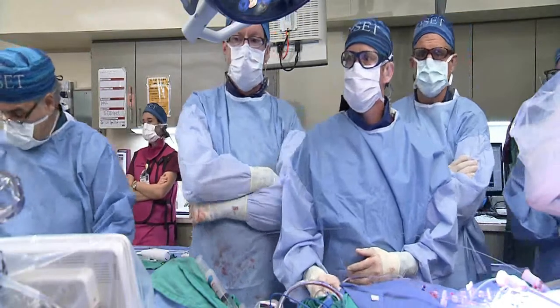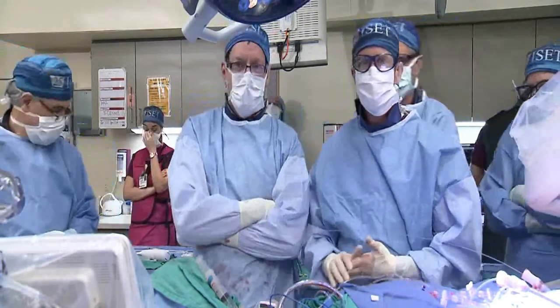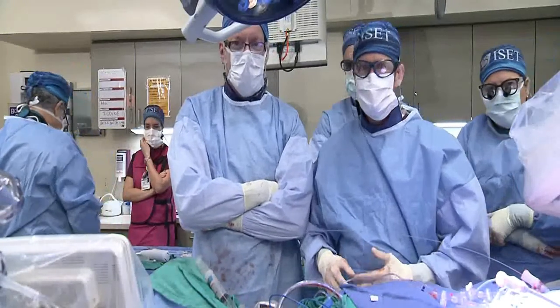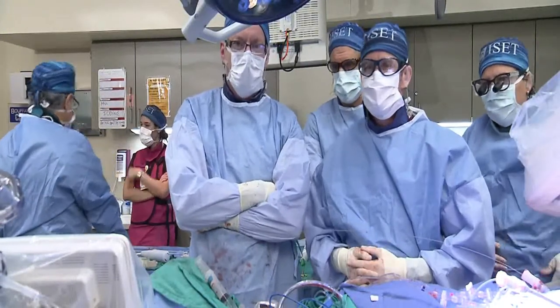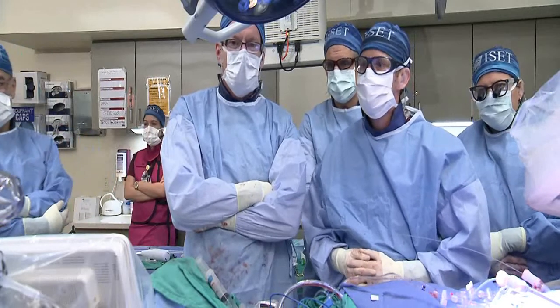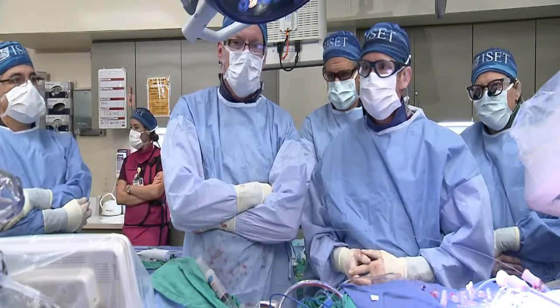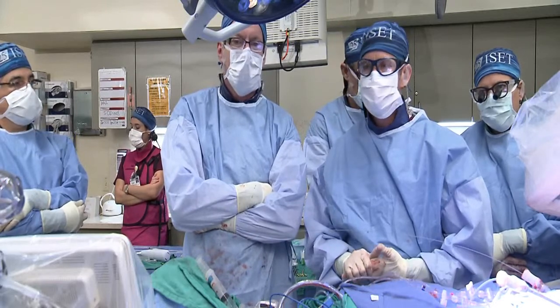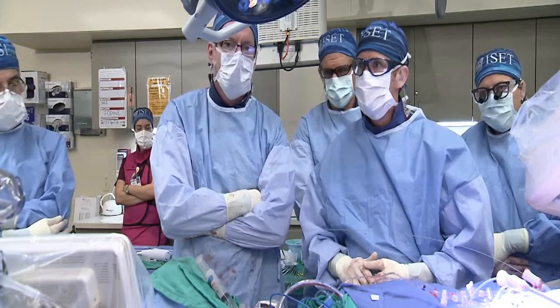In room 7, Jim, Sean, you're on here. Hey there, hi Alex, hi everyone on the panel, hello our guests. We have an interesting case from a couple different technical aspects to discuss with you. I'll turn it right over to our fellow Matt Cronin who will walk you through our patient this afternoon.